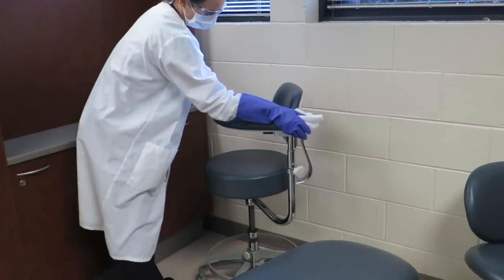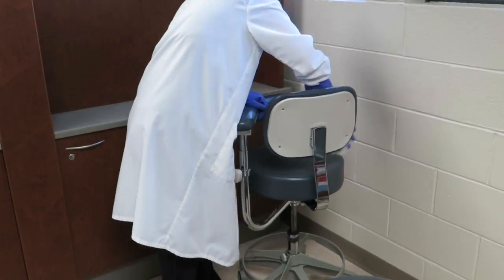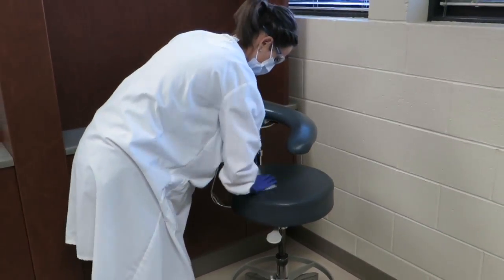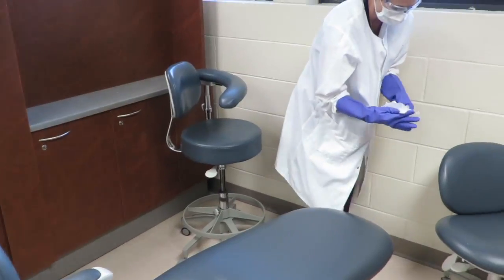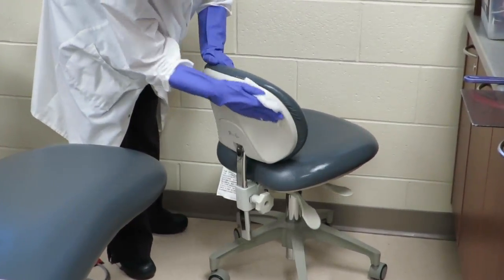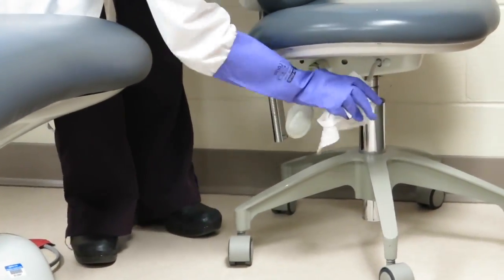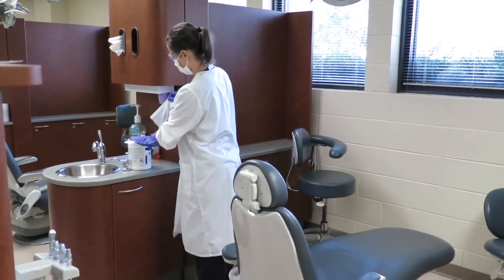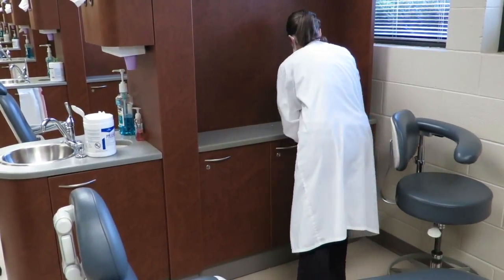Be sure to clean the assistant's chair, including the arm, its level underneath, and the height adjustment knob. The clinician's chair should be wiped to include the seat, backrest, and the hard surfaces, including all levers. You will need to wipe the counters within the operatory as well as the cabinet doors and the handles.